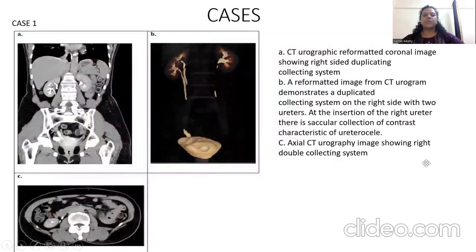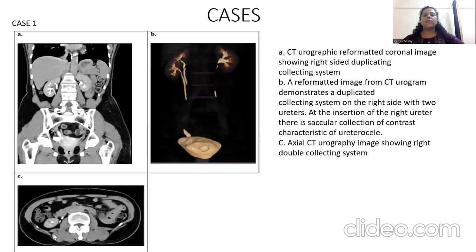Coming on to the cases. Case number one: this is the CT urography reformatted coronal image showing a right-sided duplicating collecting system. Image B is a reformatted image of CT urography demonstrating a duplicate collecting system on the right side with two ureters. At the insertion of the right ureter, there is a circular collection of contrast characteristic of a ureterocele. Image C is an axial CT urography image showing the right double collecting system.